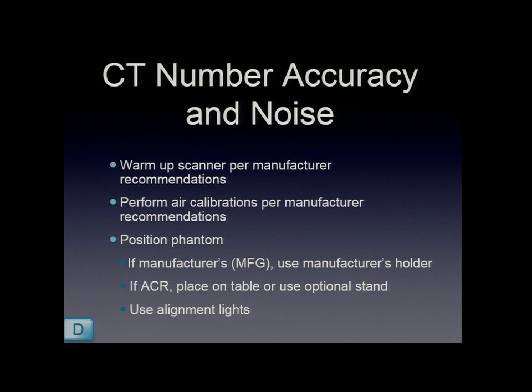Before the technologist is going to be doing the QC that's due, they need to warm up the scanner per the manufacturer's recommendations. A lot of times, you come in first thing in the morning, the scanner's been sitting down all night, so it needs to be warmed up so that it's conditioned so that you're not getting artifacts that are due to the fact that it's a cold tube and the electronics have just been sitting around. So you want to just make sure that that's done.